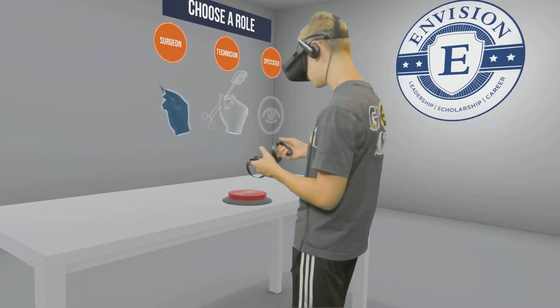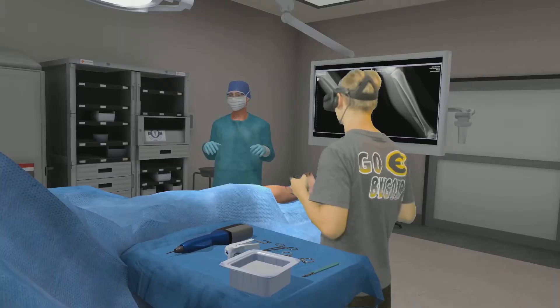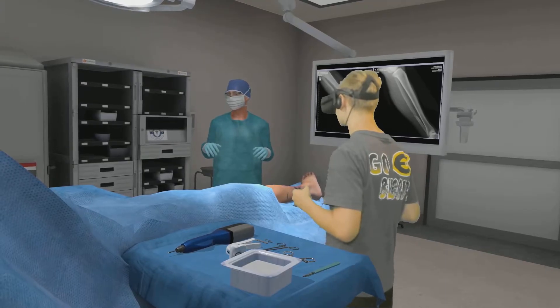Press the start button to begin. Keep your hands above the operating table and in front of you at all times.